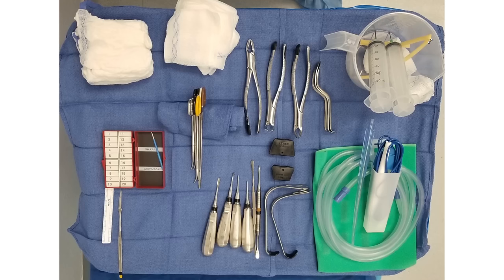Here's our quarter inch Penrose drain, that yellowish drain there. And then we've got a couple of wet Raytex here that'll be used for a throat pack. This green thing back here is an Instramag. It's a magnetic pad that we can unfold and lay on the patient that will let these instruments stick to it so that we don't have to worry about them sliding off onto the floor.